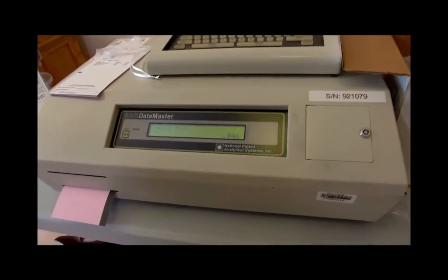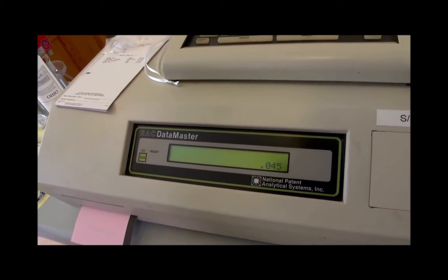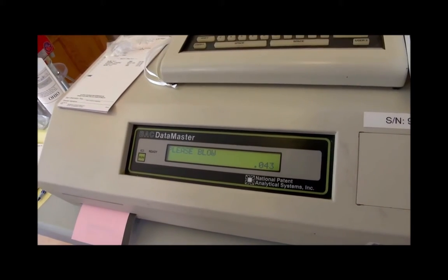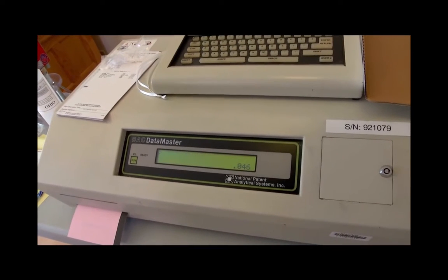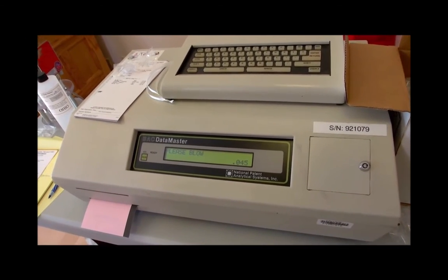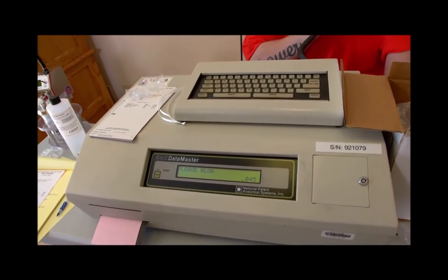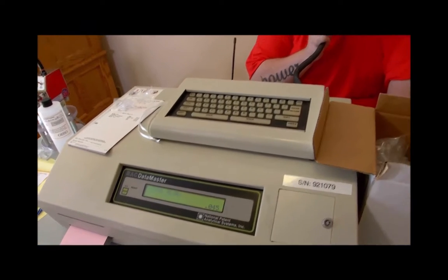Now David's going to huff and puff for a period of about 2 to 3 minutes. See, the machine can go up and down, but when it drops to that minimum flow rate, it doesn't trigger an invalid sample. It's only when that minimum flow rate's been met.